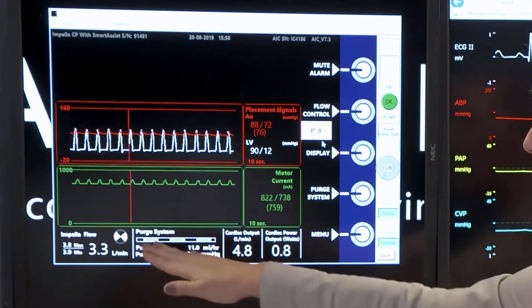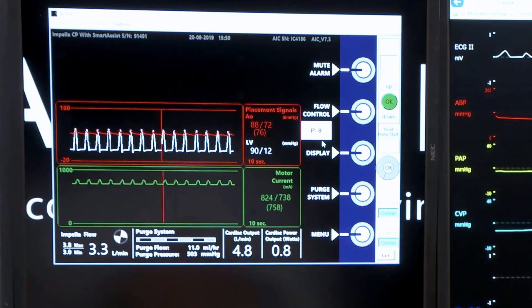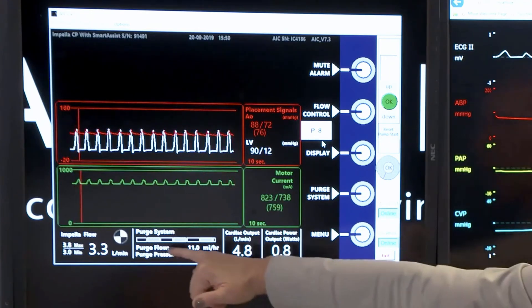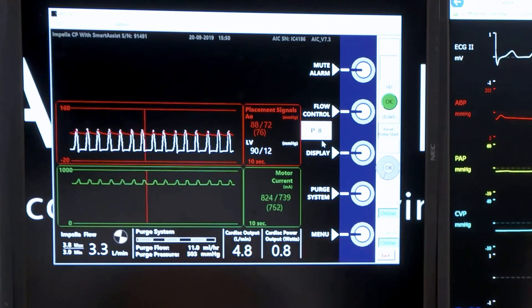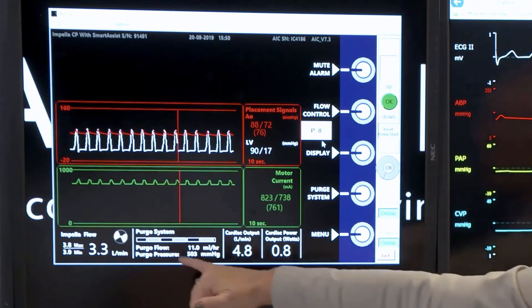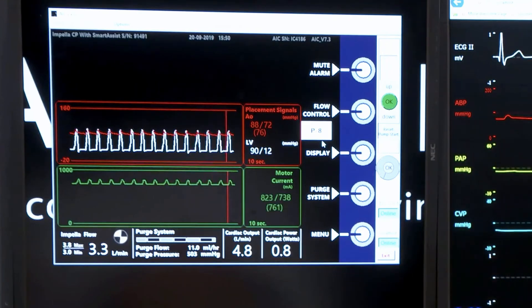The middle of our screen is going to look at what's happening with that integrated IV pump. This is going to tell us that purge flow or the rate that that purge solution is going, as well as the purge pressure that's behind that purge flow.